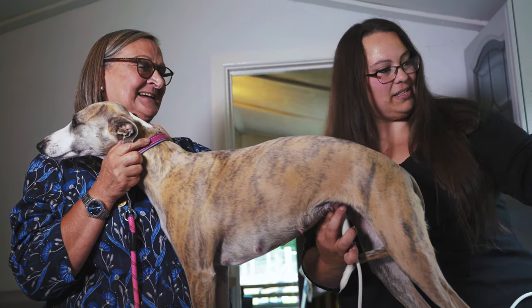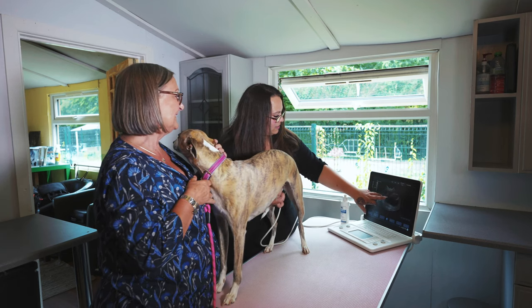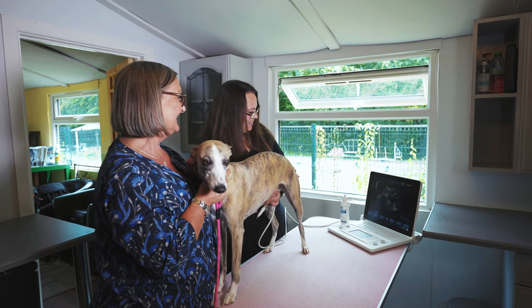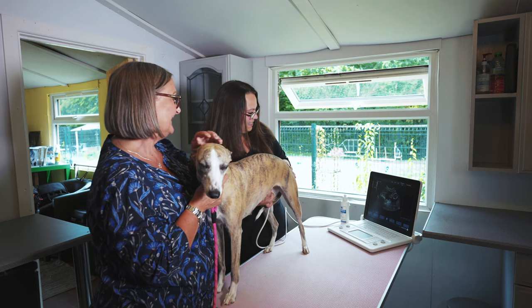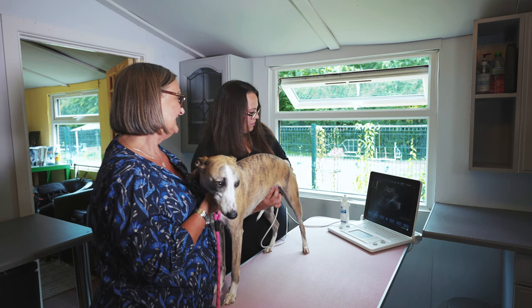This is a beautiful skull here, and you can see the eye there. We actually got a little wave from a beautiful little paw, which is always lovely to see.